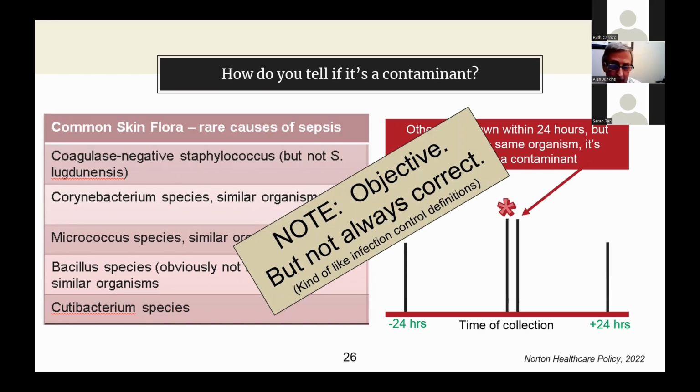It's not always correct. I kind of look at this similar to infection control definitions. Those of you who have to deal with infection control definitions all the time will say, this case meets the definition of a healthcare acquired infection. I know it's not. I know this patient had C. diff when they came in, but we didn't test it in time. So it meets the definition, even though it's not real. So there'll be situations here where there are some that we call a contaminant that really aren't. And there'll be situations where there are bugs that are skin contaminants that we don't call because of this situation.